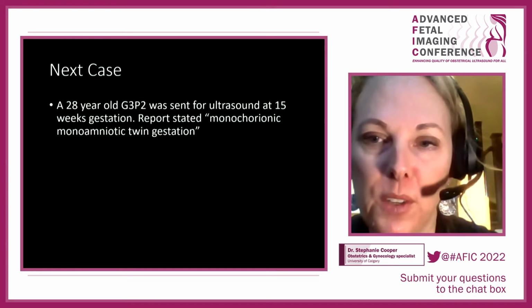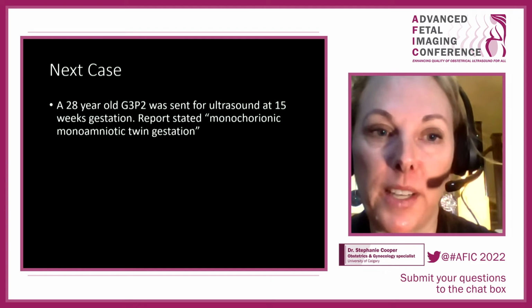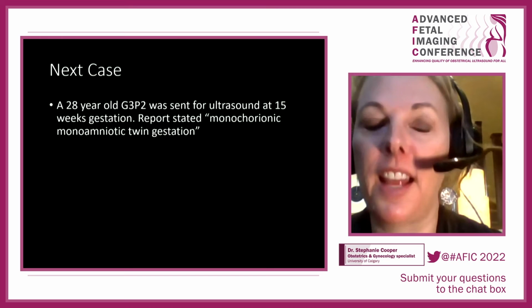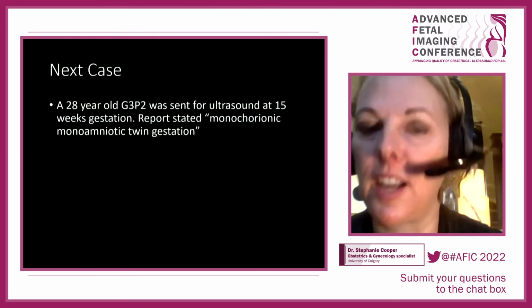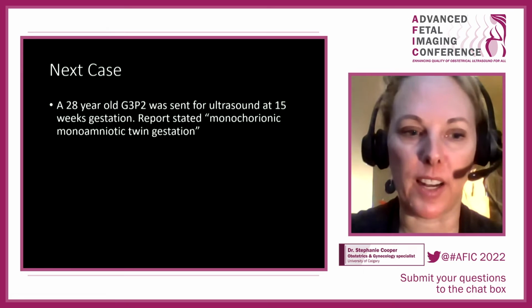So, a 28-year-old G3P2 sent for ultrasound at 15 weeks. Now this time, remember, she's over 10 weeks gestation. The report said monochorionic, monoamniotic twin gestation.